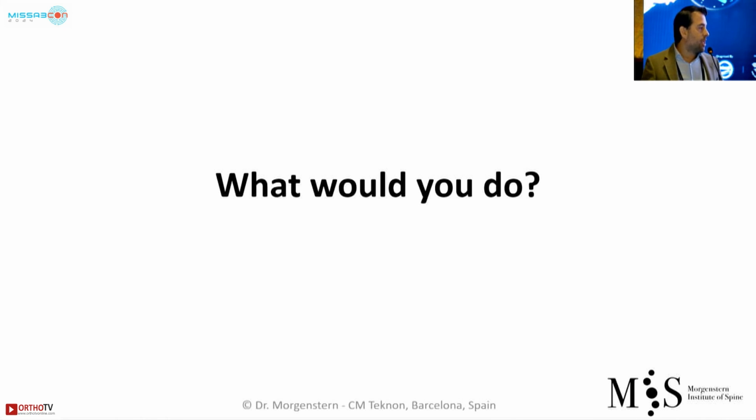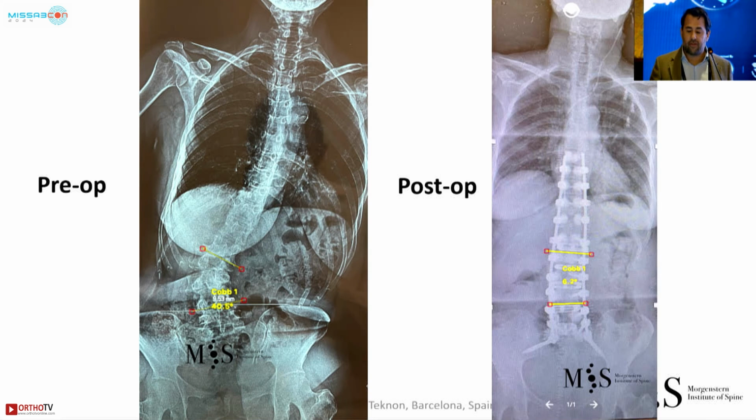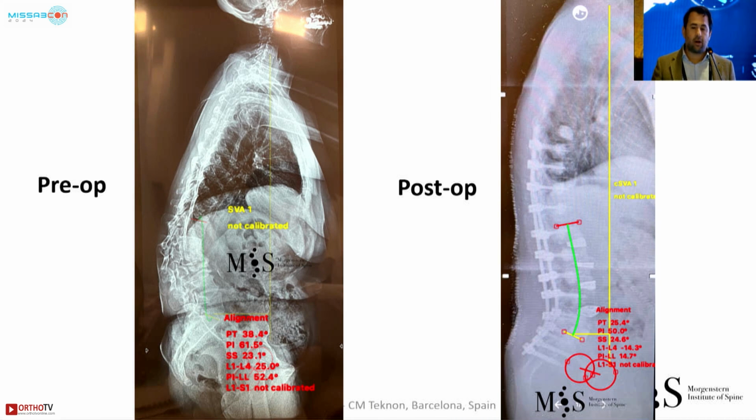I'm almost finished. With Parkinson's patients, my experience is, if you go only posterior, screws always loosen up. It's a matter of time. So you're running against time. You need to get the bony fusion before the screws loosen up. So I went anteriorly, with a hyperlordotic ALIF cage. You can see I got it down to 5 degrees coronally, and I gained about 35 degrees of lordosis sagittally.